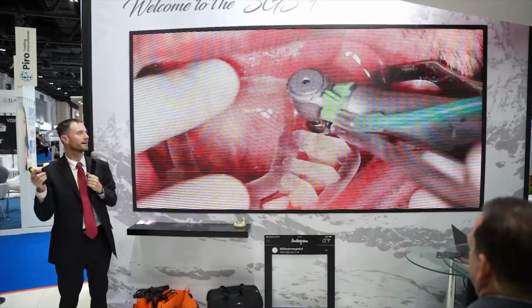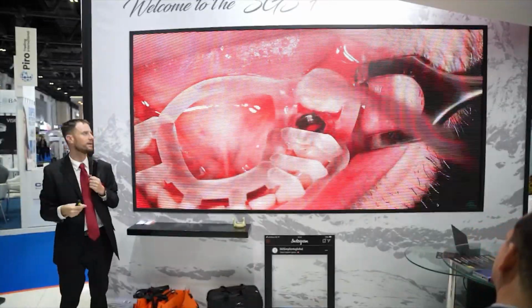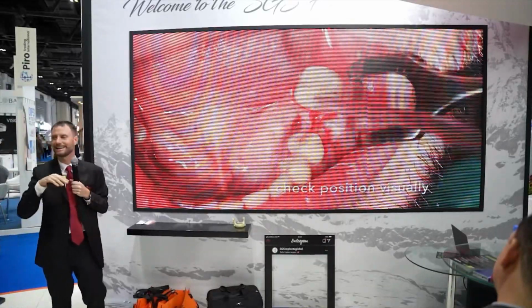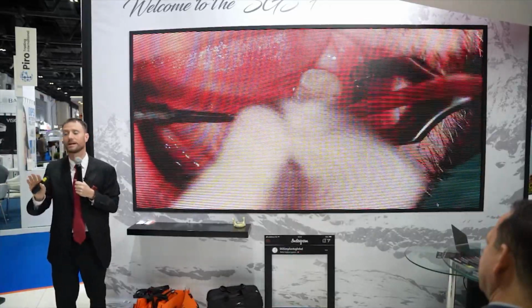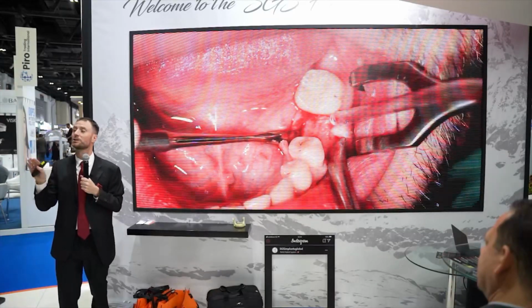And then this is the guide system itself, the drilling you do with a bone mill, and then you go one by one with the different drills according to the lengths you wish. I like to have a control. When I first drill, I remove the guide and have a look. I never trust blind. You know, digital workflow.